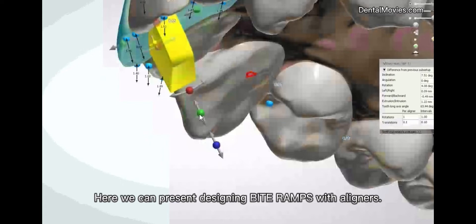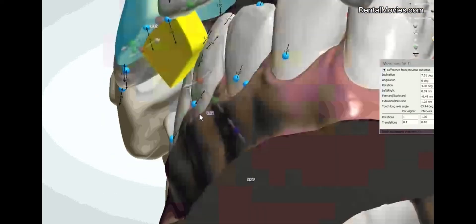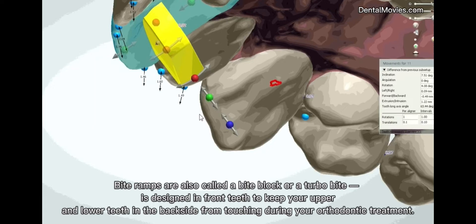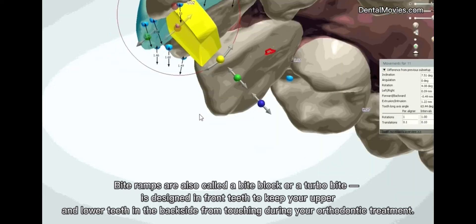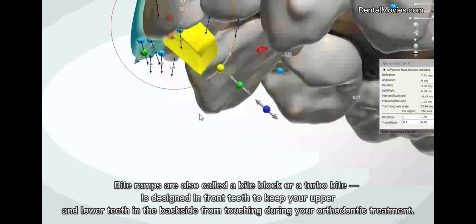Here we can present designing bite ramps with aligners. Bite ramps are also called a bite block or a turbo. They are designed on front teeth to keep your upper and lower teeth in the backside from touching during your orthodontic treatment.